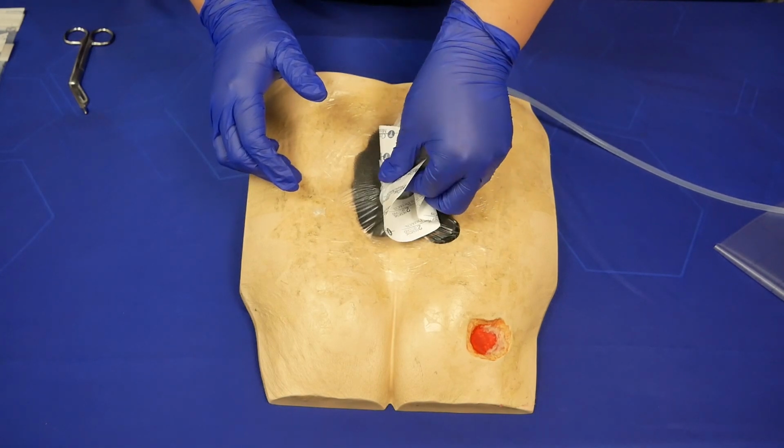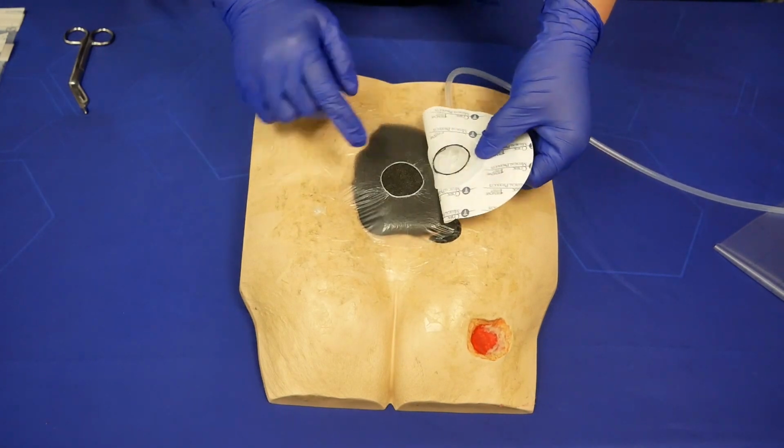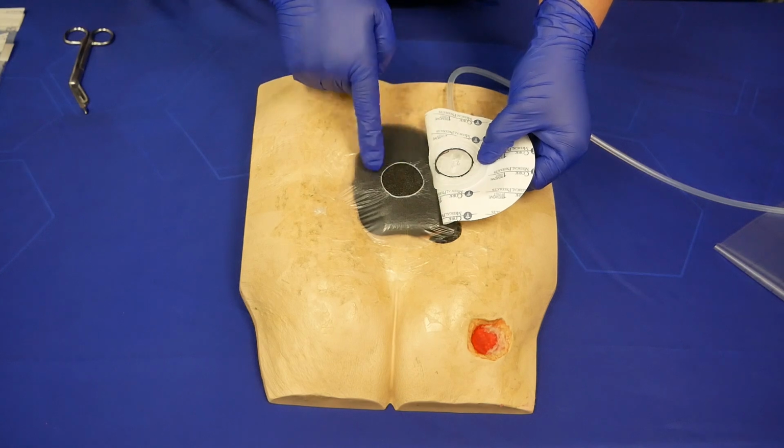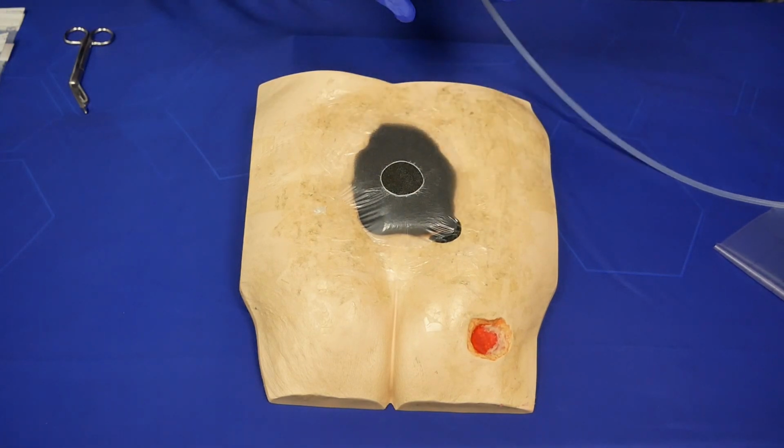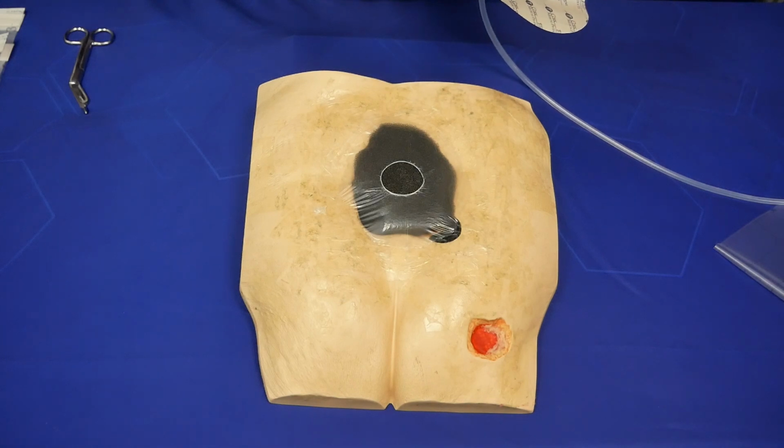You can even roll it over so you know exactly that your port pad hole opening is edge to edge over the dressing. So we'll go ahead and we'll do that now.